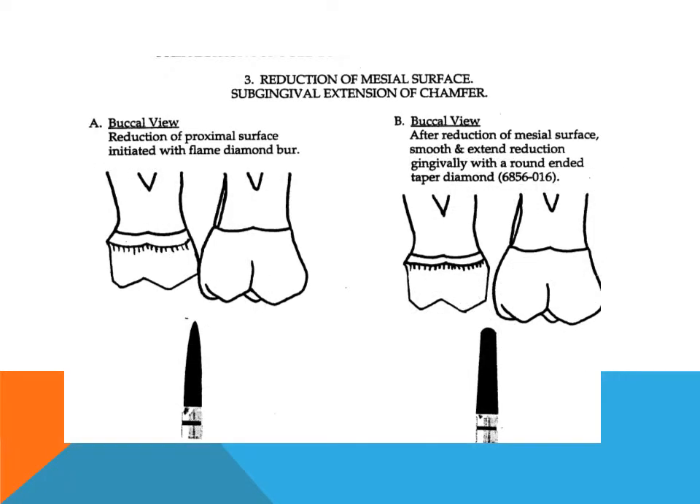Reduction of proximal surfaces: The diamond burr was used to extend the buccal and lingual reductions as far as possible onto the proximal surfaces without touching the adjacent tooth. In order to avoid cutting the proximal contact areas of the adjacent teeth, the proximal reductions are continued with a flame-shaped diamond burr. With a buccal approach, the burr is used to gain access to the proximal walls. A thin layer of enamel is maintained between the burr and the adjacent tooth to protect its contact area.